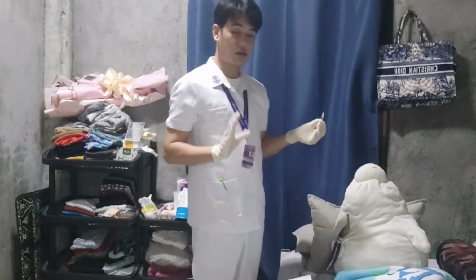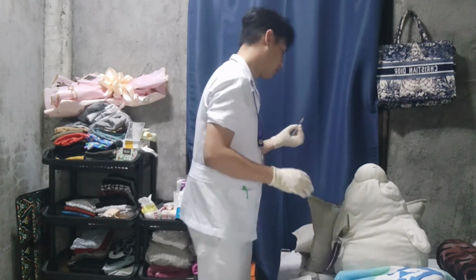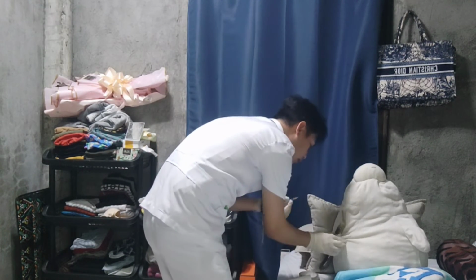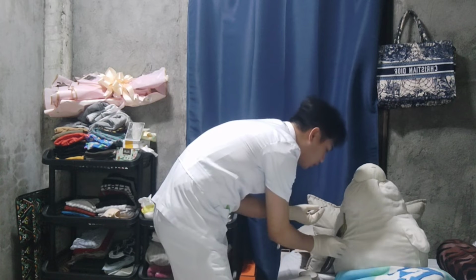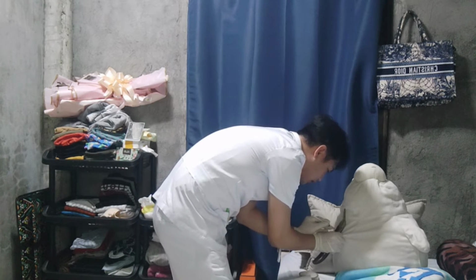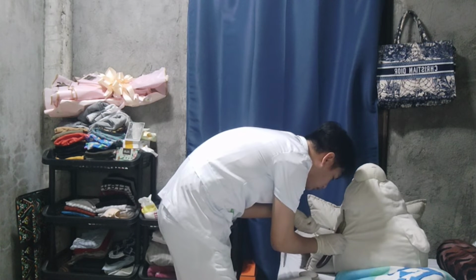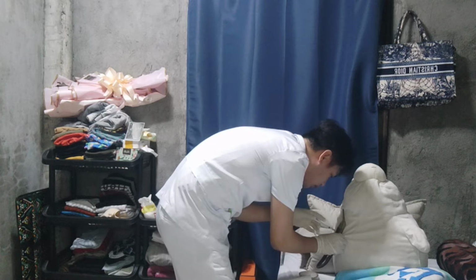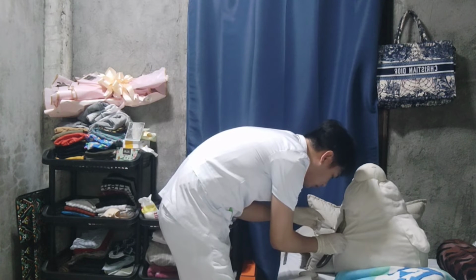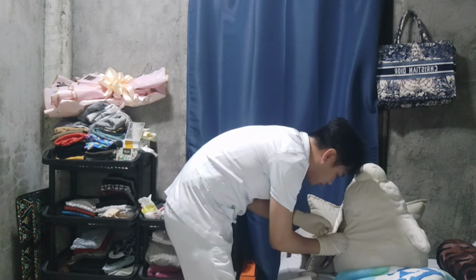So, we're going to administer the medication now. We need to inject at 90 degrees. Then, aspirate, then push. So there is no blood drawn. Then pull.